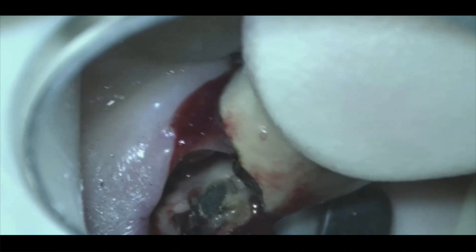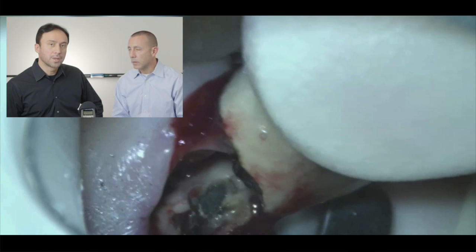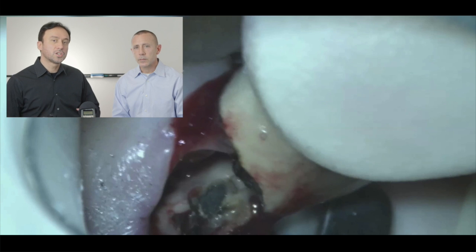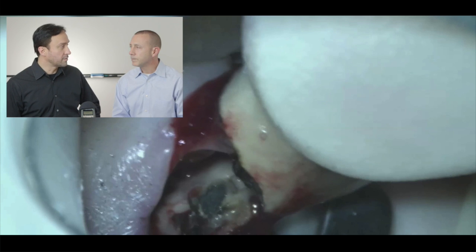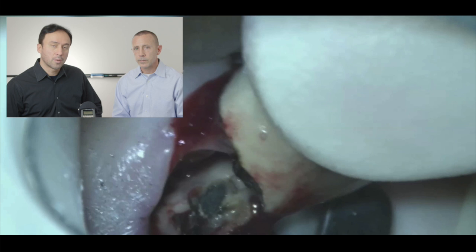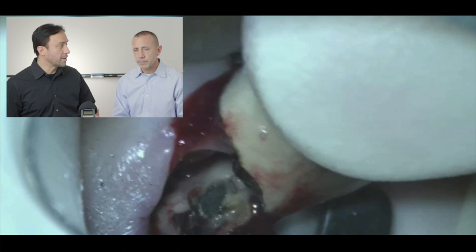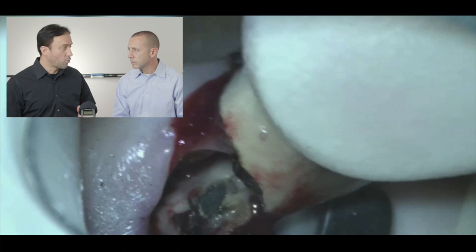At this point there is not a whole lot of tooth remaining. Even with the mobility, it was pretty tight — fractured teeth can hang in there pretty strong. Once you remove the tissue, the underlying area is healthy and doesn't really have any periodontal problems. So the tooth can be safe provided there is enough clinical crown or coronal structure to biomechanically retain the ensuing restoration.